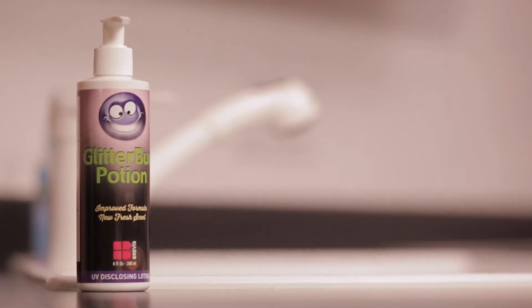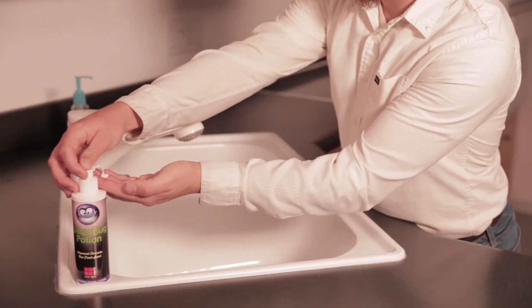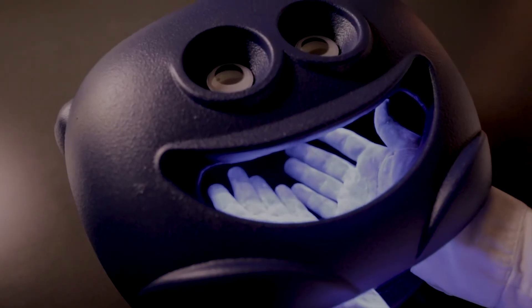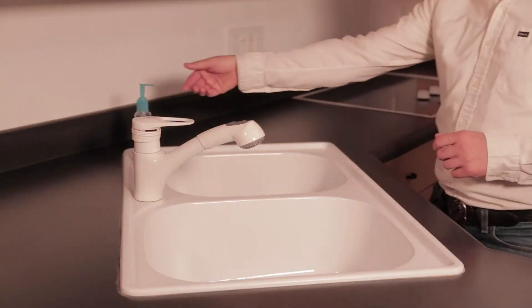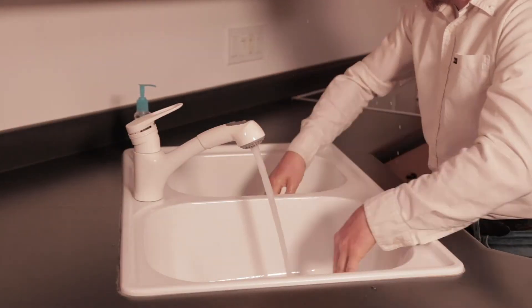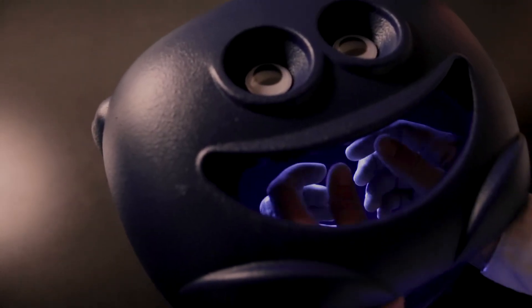Tying the whole package together is the Glitterbug Potion Hand Wash Disclosing Lotion. Apply the Glitterbug Potion and rub it in on your hands. View your hands in the GBX and you'll see your entire hands glow. Now go wash those hands as you normally would. This time the GBX shows us those spots and areas that were not cleaned well.